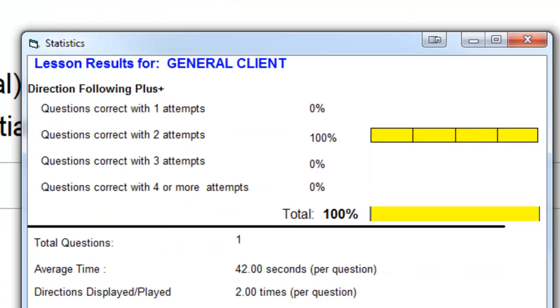It also shows the patient how they did after every lesson in an easy-to-read thermometer-like graph. If you want the user to wait until the complete direction is spoken before performing any part of it, to work on memory, you can check the impulsivity feature. Put the blue circle above the green circle. Please wait for me to finish the directions before you start moving shapes. I'll repeat the directions now.